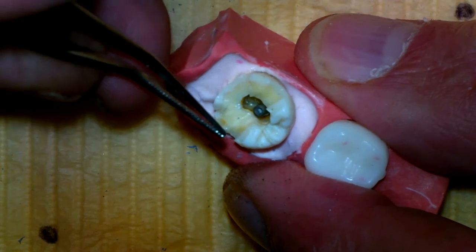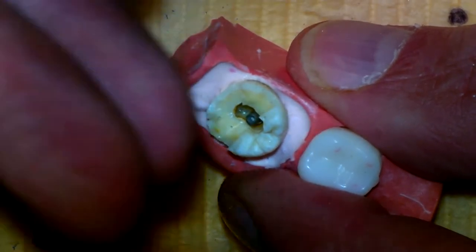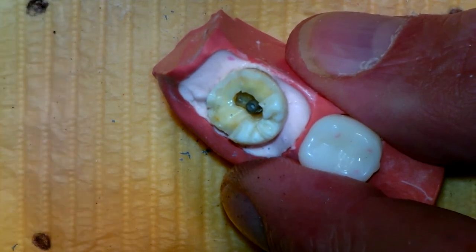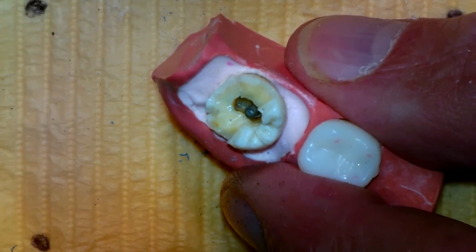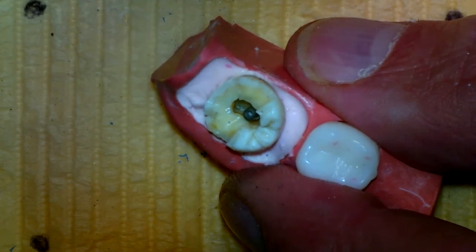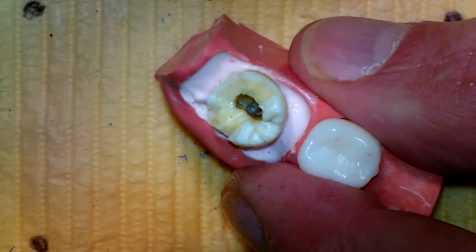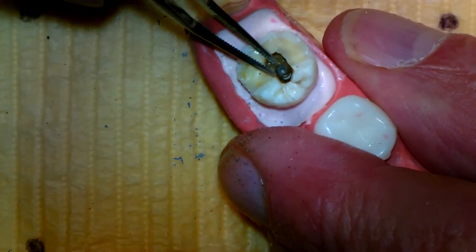If the post is sticking up too high into the chamber of the tooth, when you prep the tooth you're going to run into it. You don't want to expose a post at the surface of a core, because that's a place for bacteria to go down between the junction of the post and the core material. It doesn't have to be right up to the occlusal surface, because you're going to cut that down to put a build-up in the tooth and prep it for the crown. It fits pretty good.